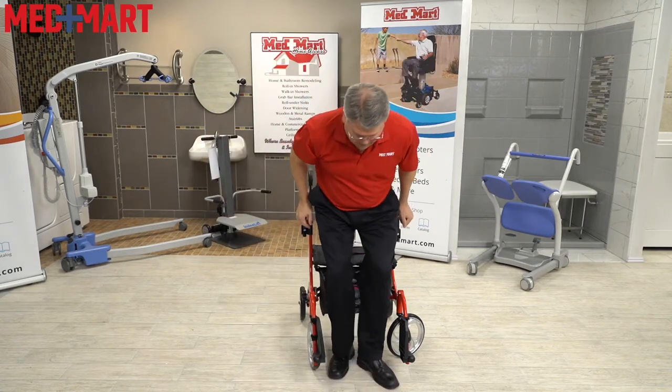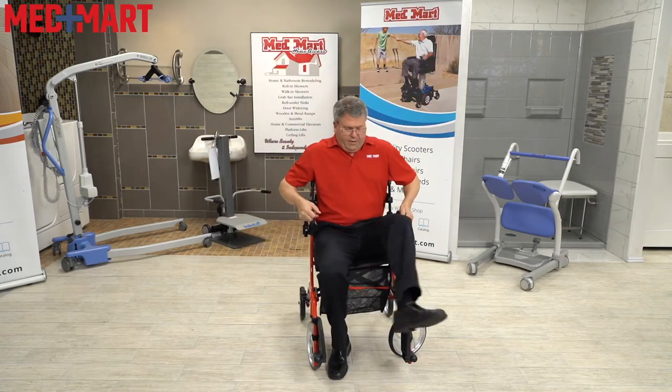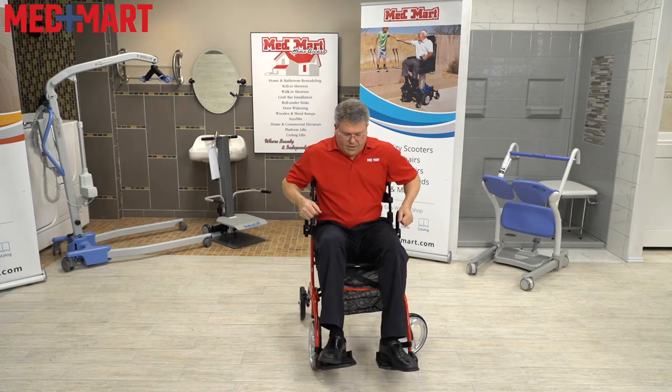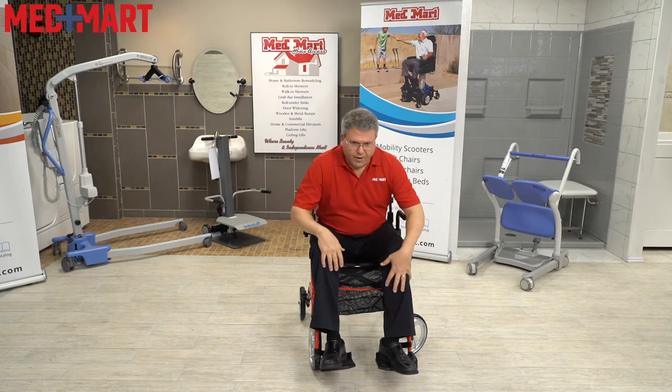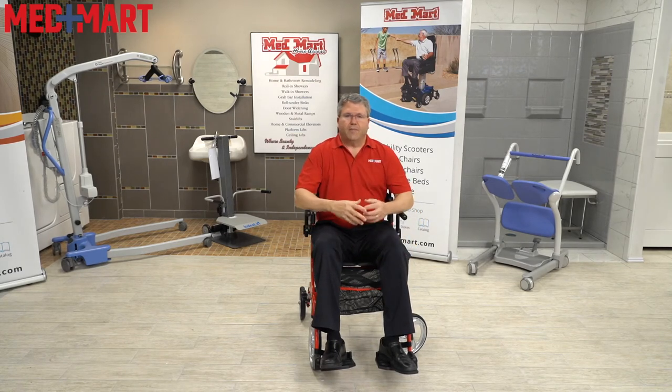Using the handles to sit down, you sit in the chair. If needed, you'd have assistance to help get the foot rest into place. And now you can be pushed around like a transport chair. Obviously, you can't wheel yourself, so it does rely on somebody else pushing you at this point. Also, if you're someone who tends to lean weight forward, this may not be the best option. But you'll be able to sit back and relax into the back support.